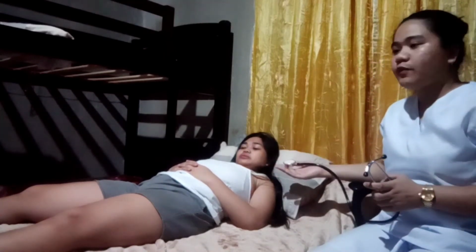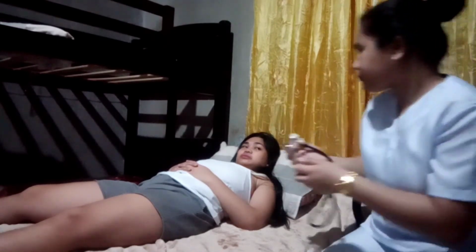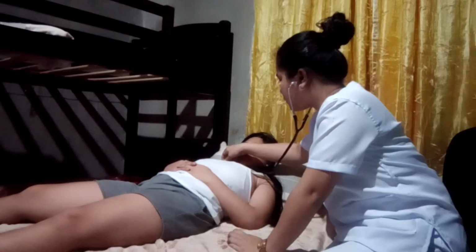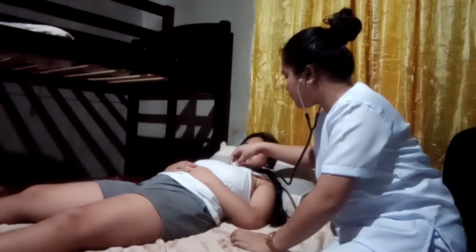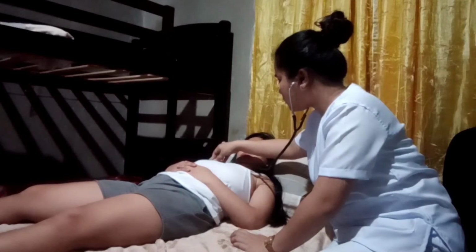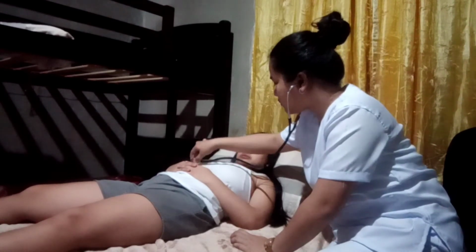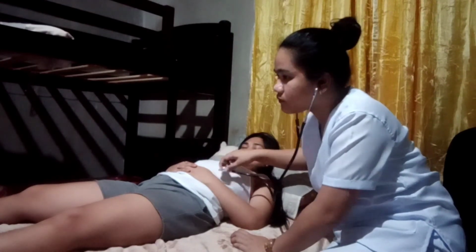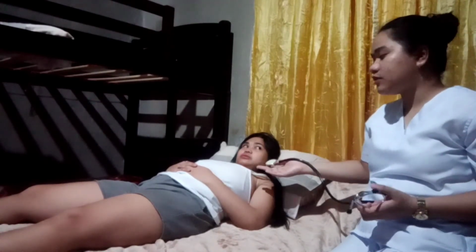And right now, I will auscultate the anterior chest with the diaphragm of the stethoscope. I also didn't hear any abnormal sounds in her lungs, so it is normal.